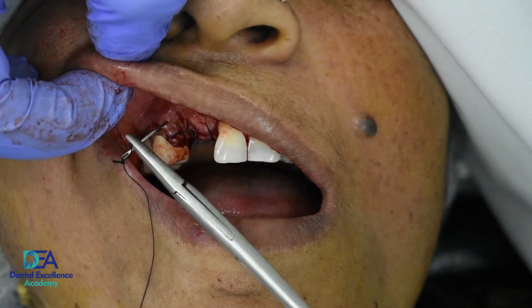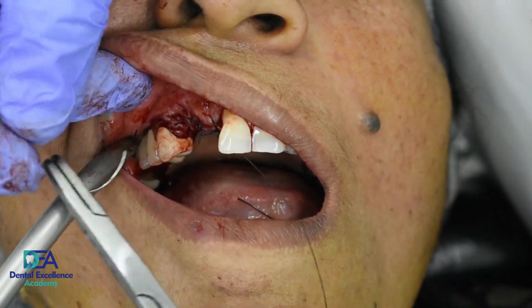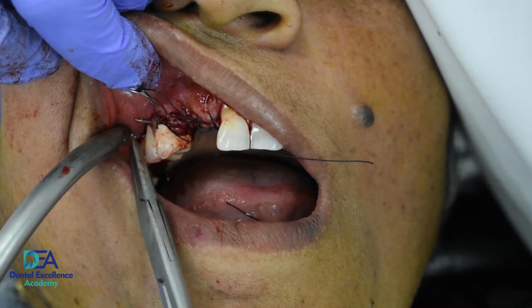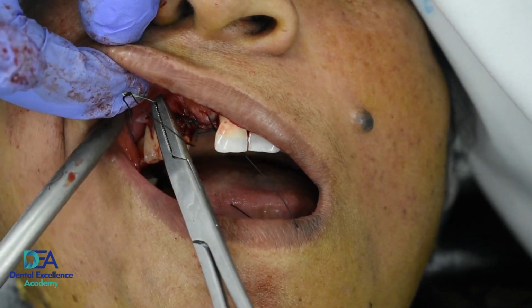So that's why I gave the vertical incision initially, so that we can cover the implant. Now I am giving sutures in the region of the vertical incision.